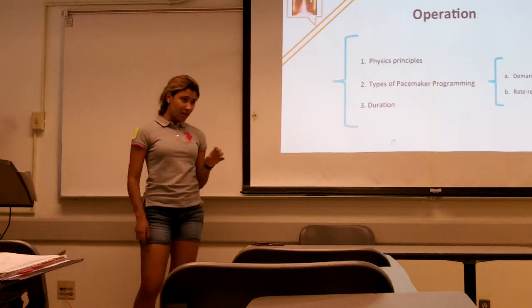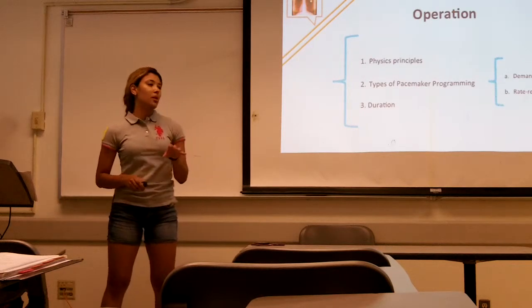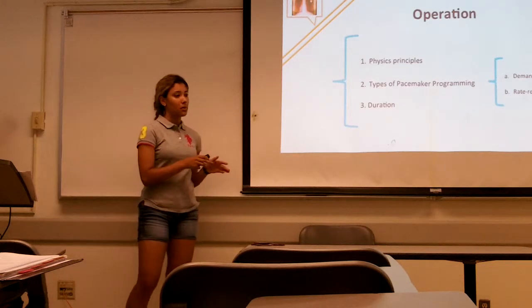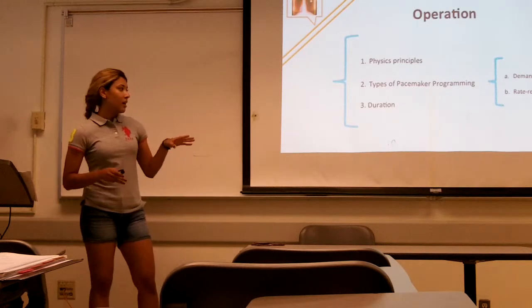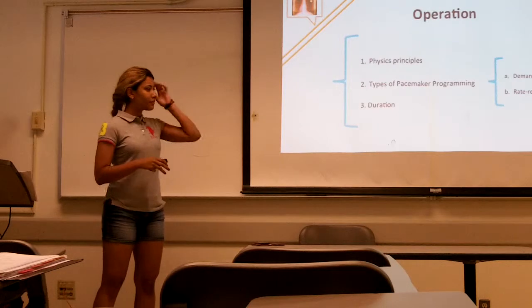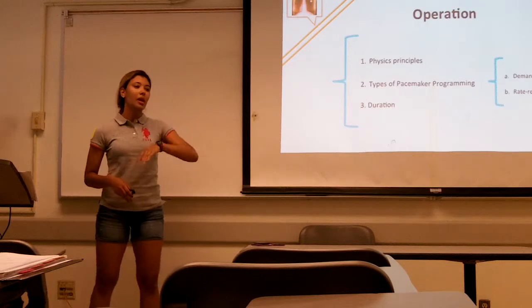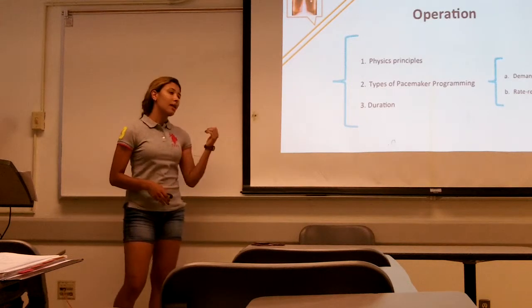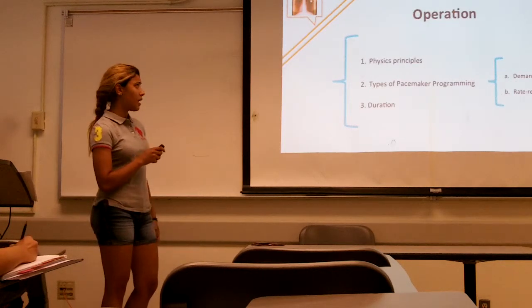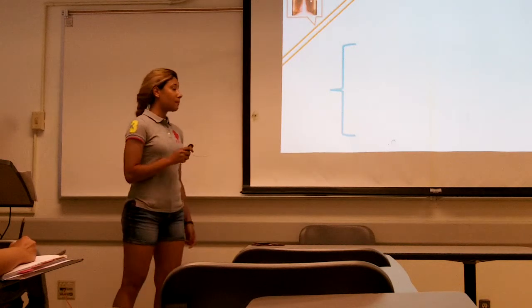So the temporary pacemaker is characterized mainly by its duration. The patient needs to stay in the hospital while he has the temporary pacemaker. The permanent pacemaker is used in most cases, okay. And like I said at the beginning, for tachycardia, bradycardia, or any kind of irregular heart rhythm. So now let's move on to our next topic, which is considerations.